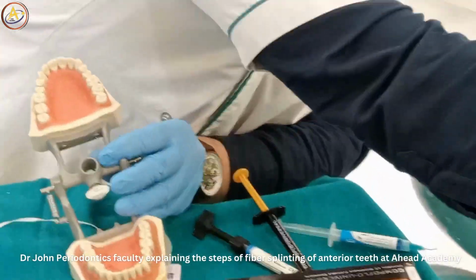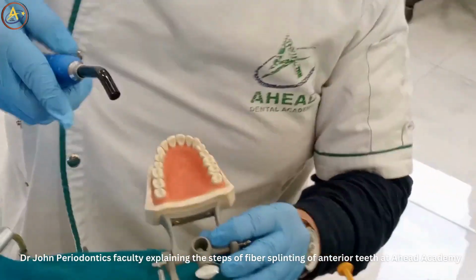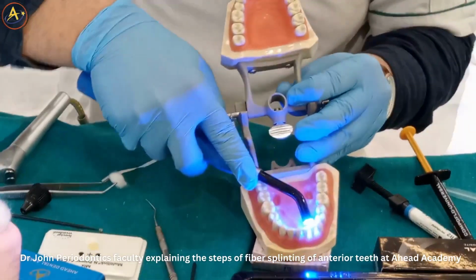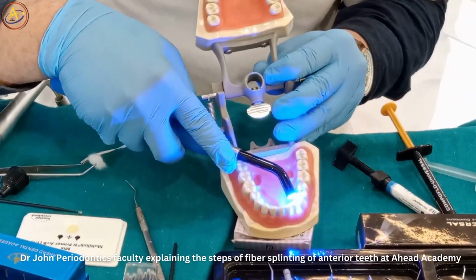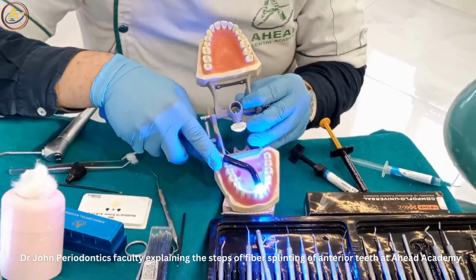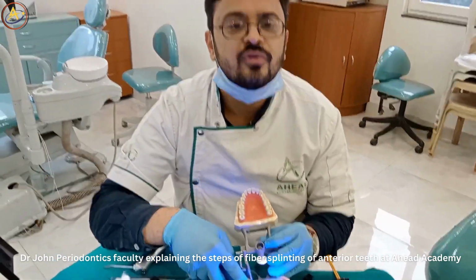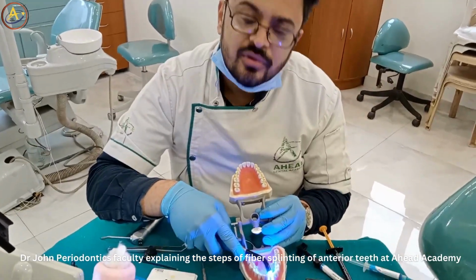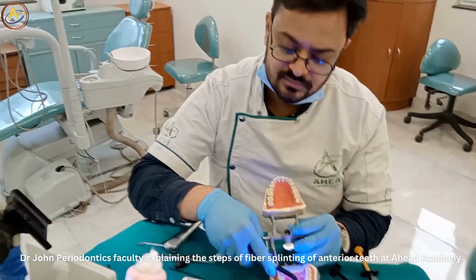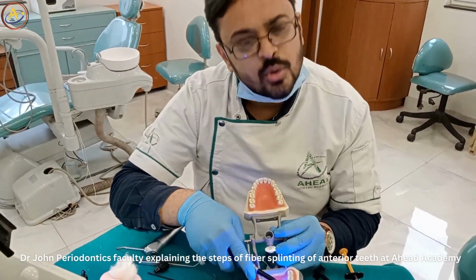with your curing light. Now, this is a very big misconception or problem with us, that when we do curing of the composite, we do it randomly like this. Never do it randomly. It is always done 20 seconds per tooth. If you are doing splinting for 4 teeth, apply bonding on 4 teeth, and curing has to be separate for each and every tooth. Okay? 20 seconds, 20 seconds, 20 seconds and 20 seconds.